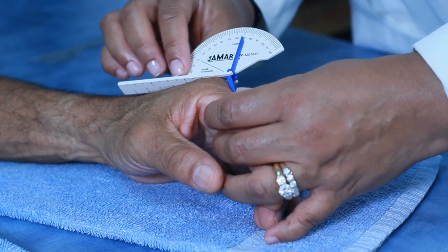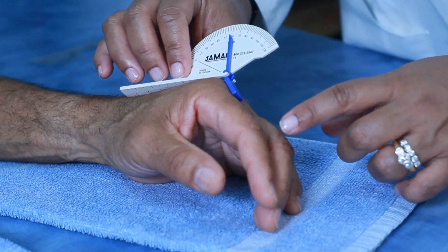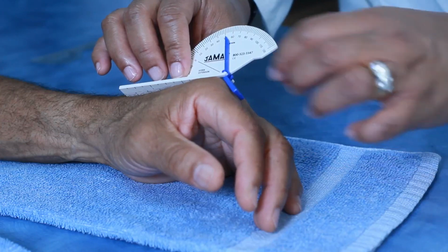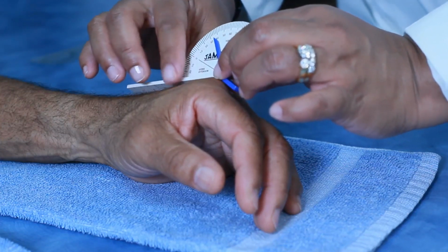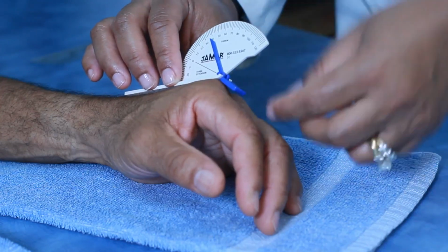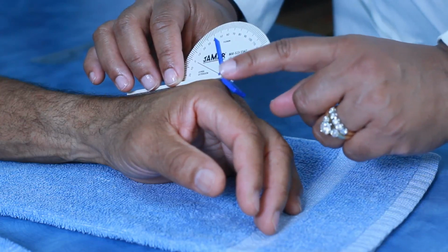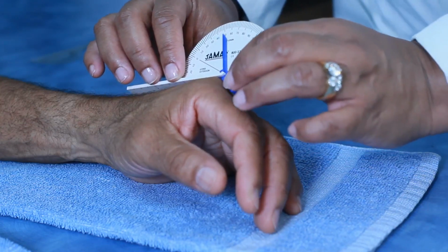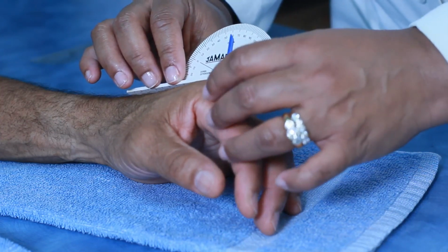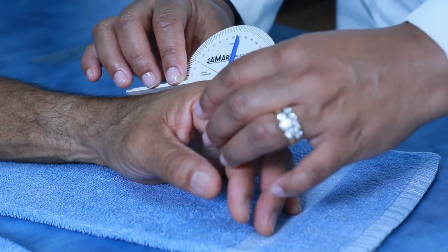the MP. Remember, for all 4 digits, the index, the middle, the ring, and the small finger, you're going to have your proximal end lined up on the dorsum of your metacarpal and your distal end of the goniometer at P1, the proximal phalanx. So with this particular digit at the MCP, we're getting to 70 degrees.